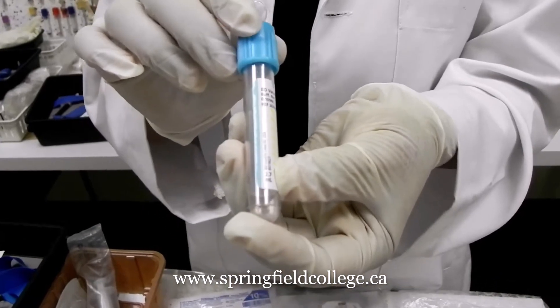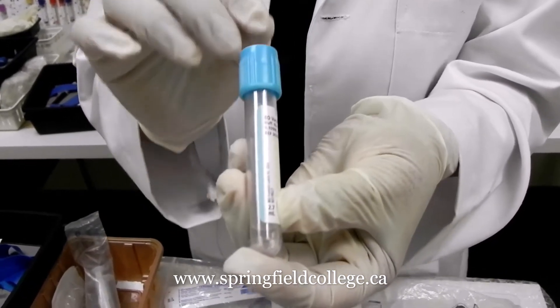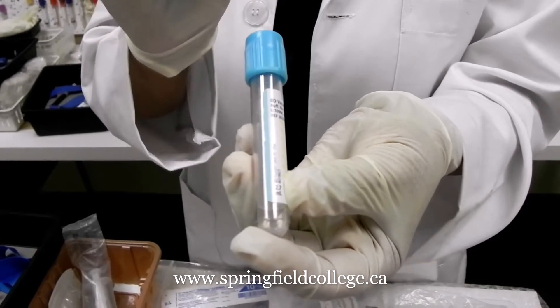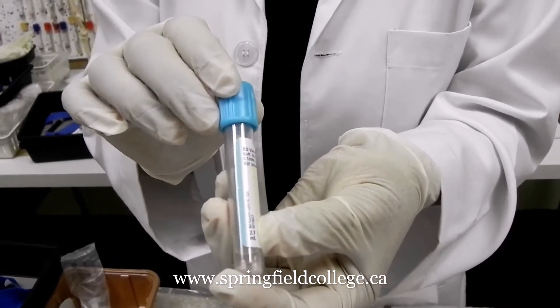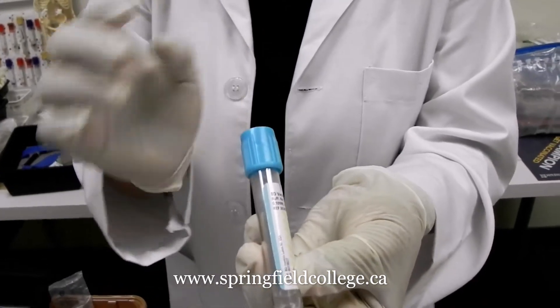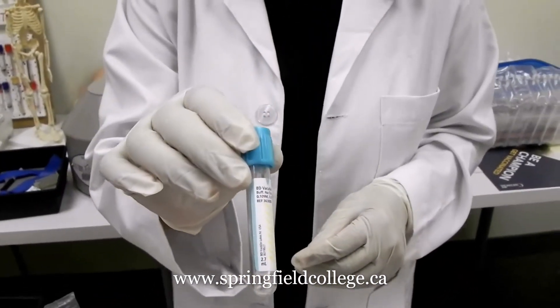If you are not going for the blood culture. Remember, if you are going for the blood culture at all, first you are going to collect the blood culture and then this one. But without blood culture, this is the first tube.